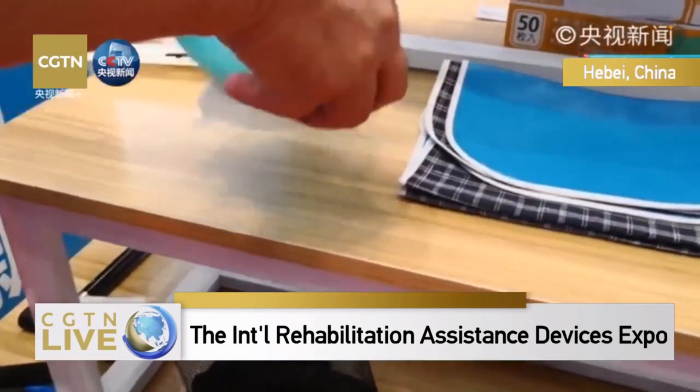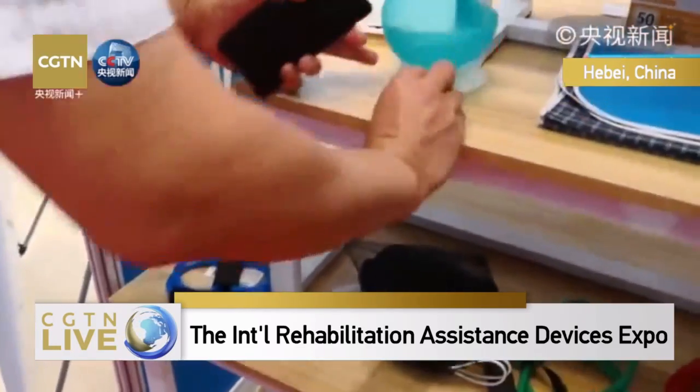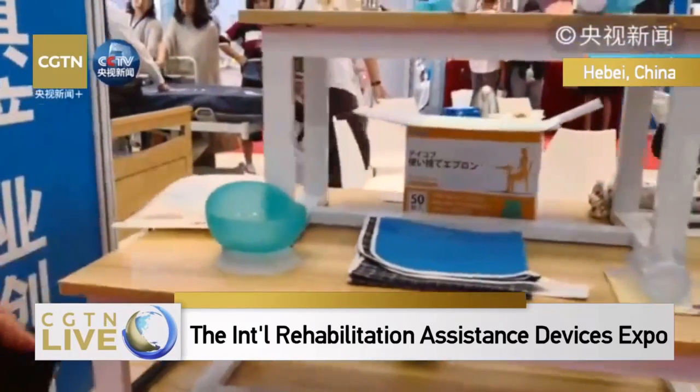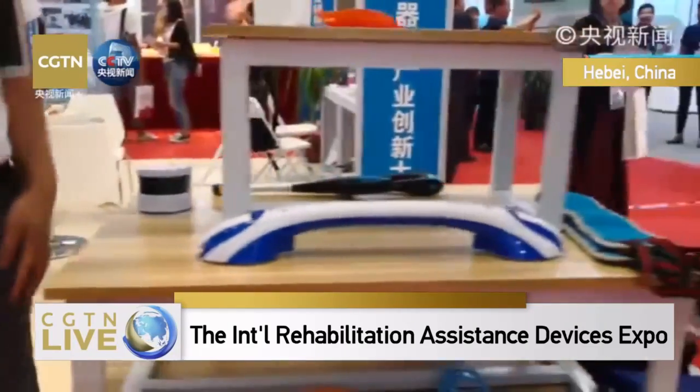when you put it on the table, it can be automatically attached to the table, so as to help with the stability when a person is eating.